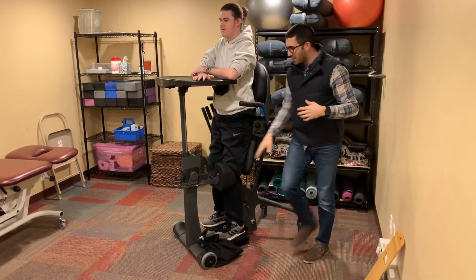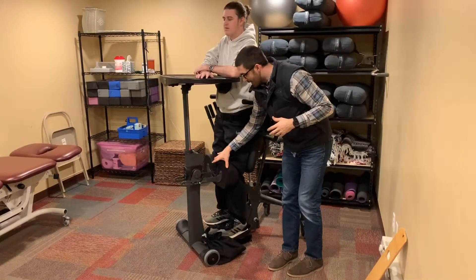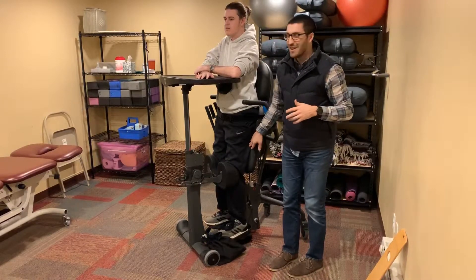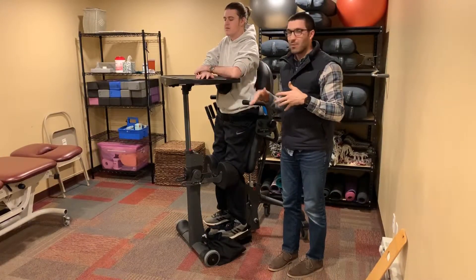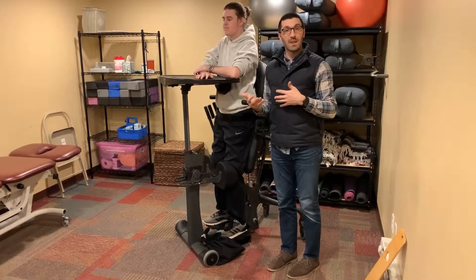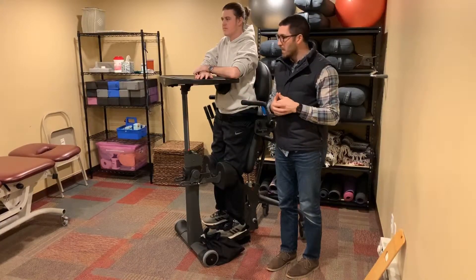There are a number of different ways you can get different types of knee blocks, different types of seats, different types of tray tables. So just make sure that you're knowledgeable in what exists and that you're using what's going to work best for you.